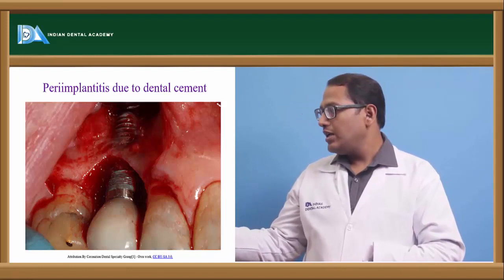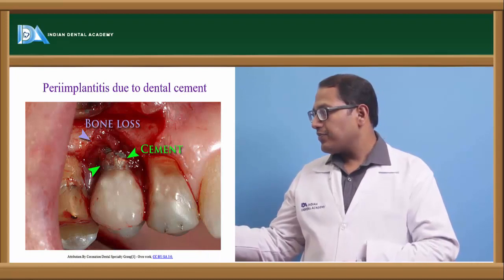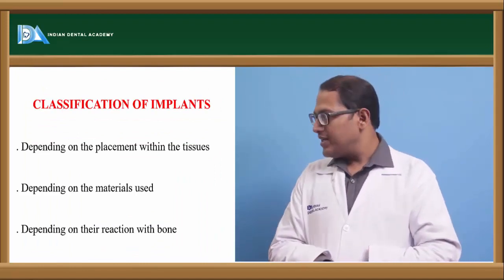You can see there is a full amount of implant which is exposed in this particular section. You can see the implant itself is exposed due to the cement which was not cleared by the dentist.